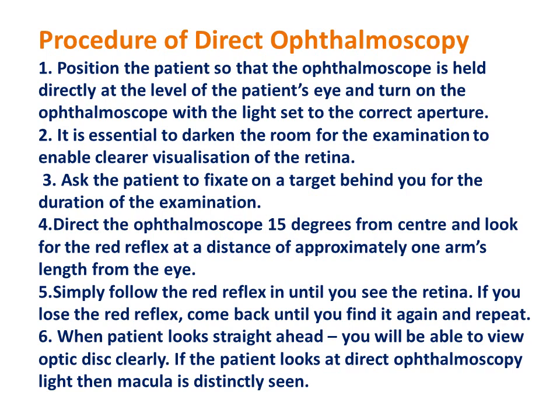When the patient looks straight ahead, you will be able to view the optic disc very clearly, and if the patient looks at the direct ophthalmoscopy light, then the macula comes into view, and then you will be able to assess the foveal reflex and the macular details when the patient looks at the ophthalmoscopy light.